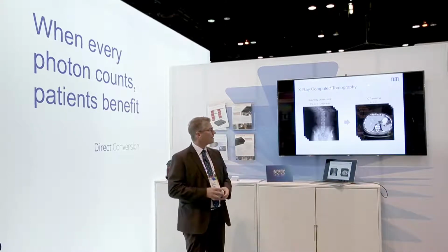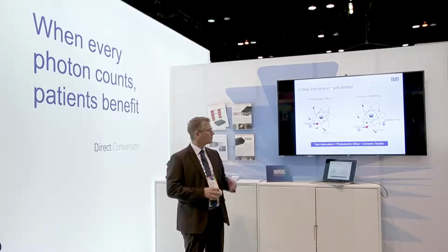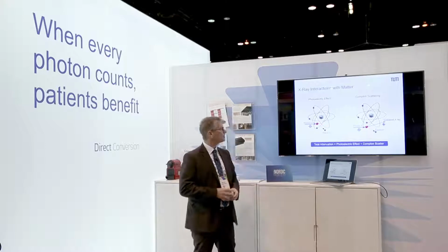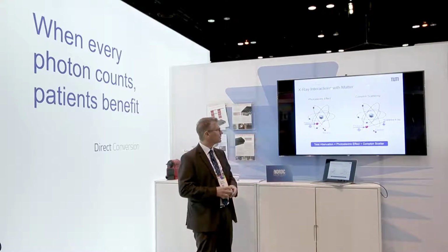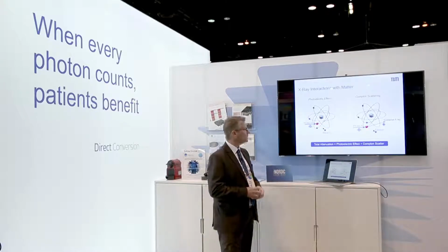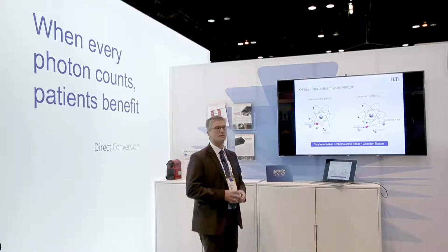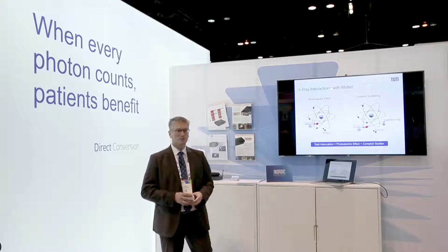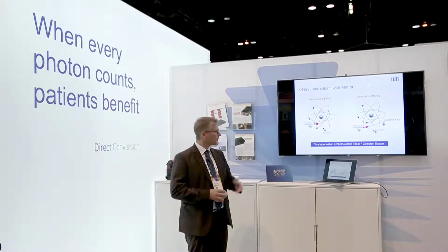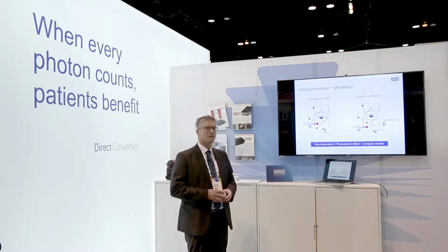If you look closely at this attenuation coefficient, you obviously know that there is the photoelectric effect, where a photon comes in, kicks out typically a K-shell electron, and then you get absorption by that, or you have Compton scattering, which creates attenuation in the body through the interaction with the photon. And that's an interaction with a loosely bound electron on the outer side of the atom.